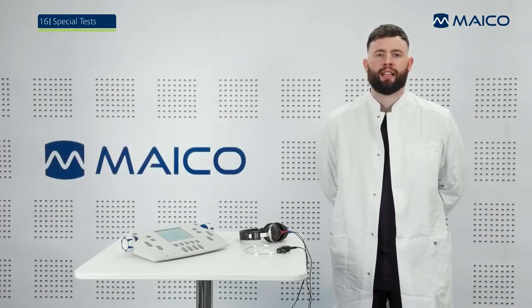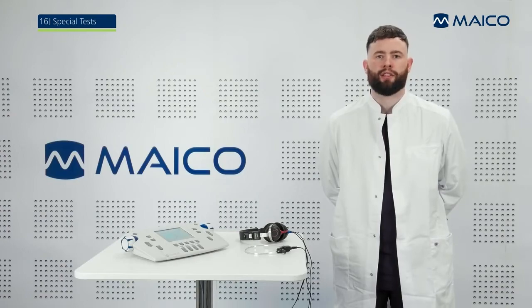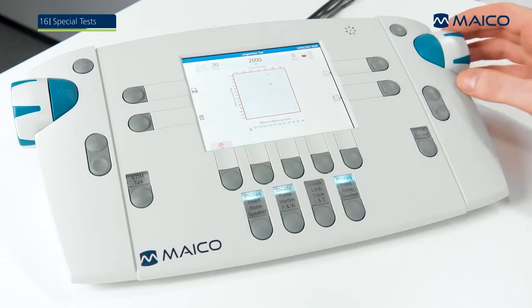The tone and noise Langenbeck test is an over-threshold test for evaluating the discrimination ability of different stimuli. Select the ear side, frequency and level of the narrowband noise. Turn on the noise presentation constantly using the appropriate stim button. After instructing the patient, measure the pure tone hearing threshold again with the standard procedure while the noise is simultaneously presented in the same ear.